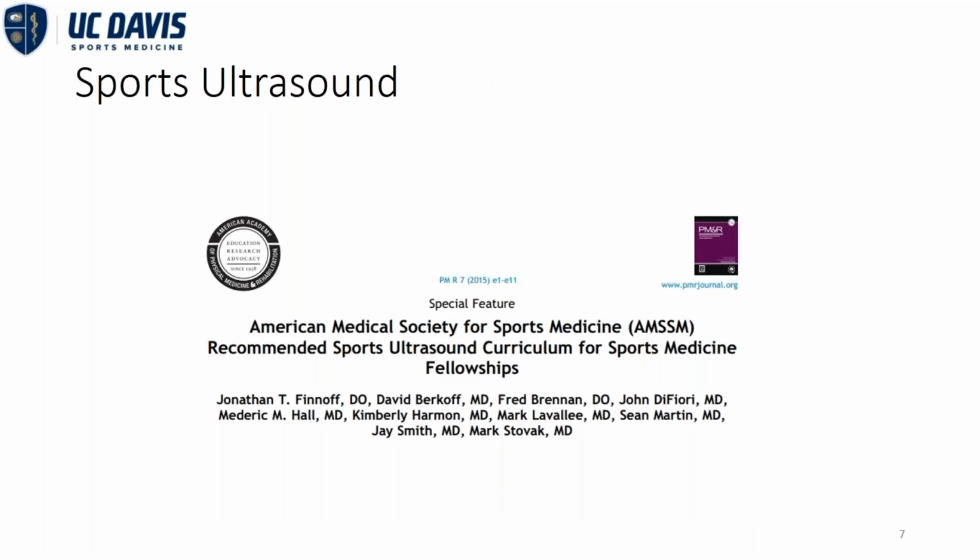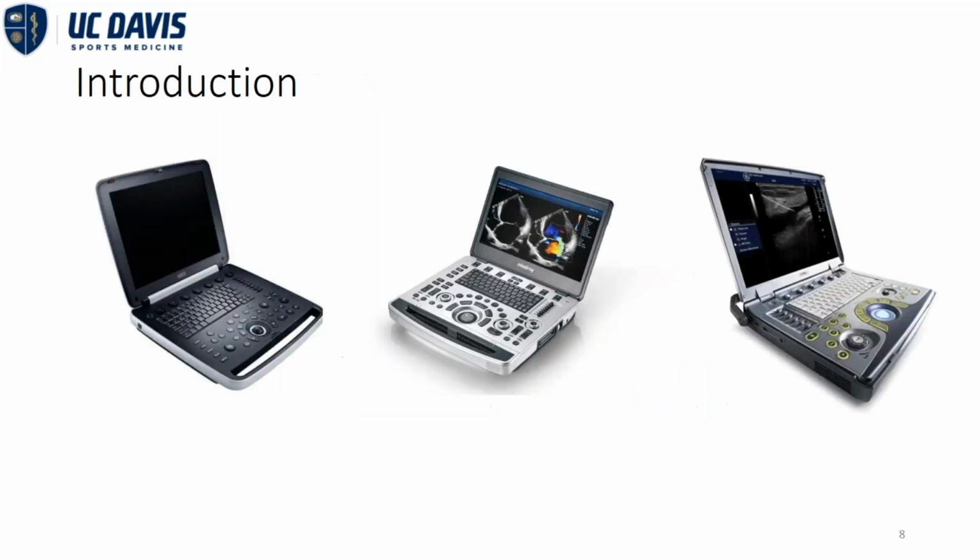To start off, I want to re-emphasize what Dr. Finoff and all these smart people described as sports ultrasound. They didn't call it musculoskeletal ultrasound. They didn't call it joint ultrasound. They called it sports ultrasound because really, when you're a sports medicine provider, you are doing so much more than just looking at joints, muscles, ligaments, tendons, and bones.